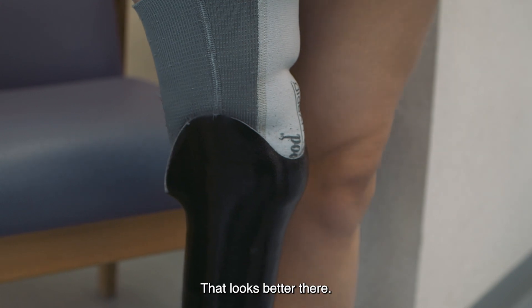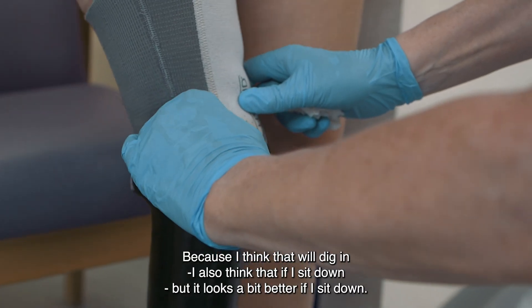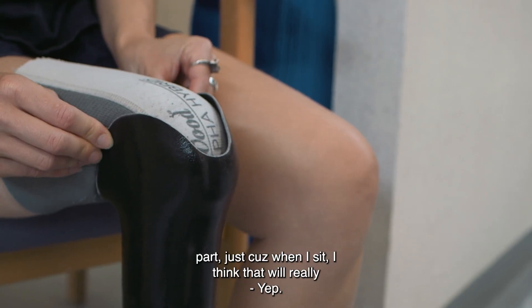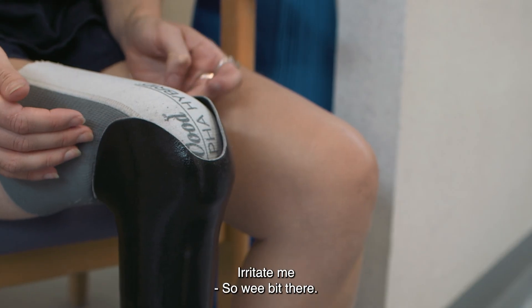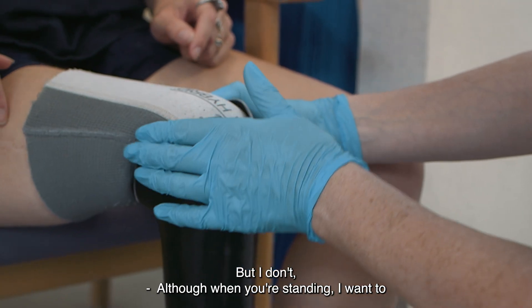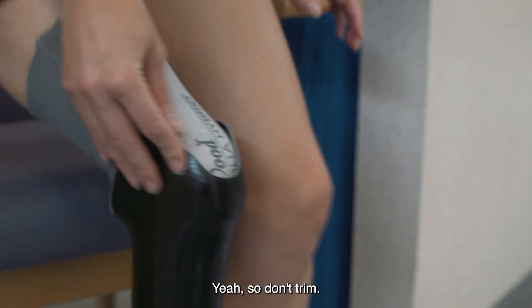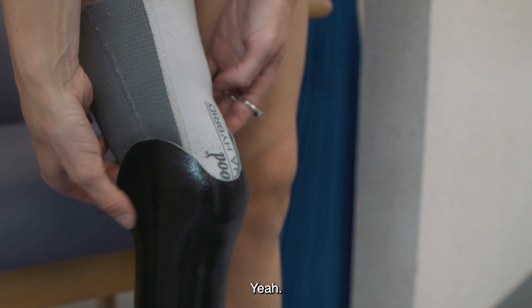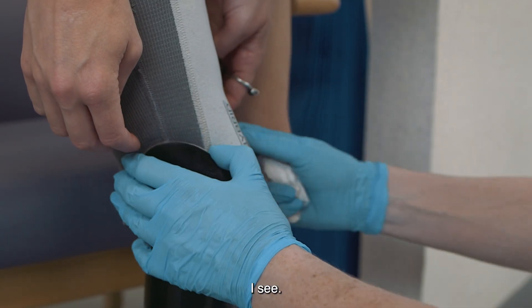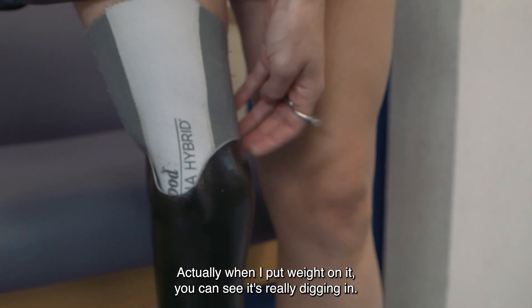That feels pretty good. It looks better there, but it looks as if that might just need a wee flare on that edge there. Yeah, because I think that will dig in, but it looks a bit better. I also think if I sit down — could we flare out both back? Just because when I sit, I think that will really irritate me. So a wee bit there, and just that corner there. Although when you're standing, I want to just flare that one as well. I quite like how high it is, so don't trim — just heat out. And it doesn't even need too much out. That corner does need to come out. When I put weight on it, you can see it's really digging in.